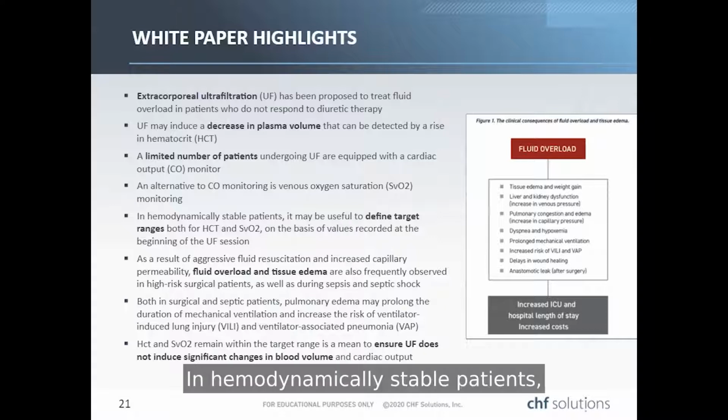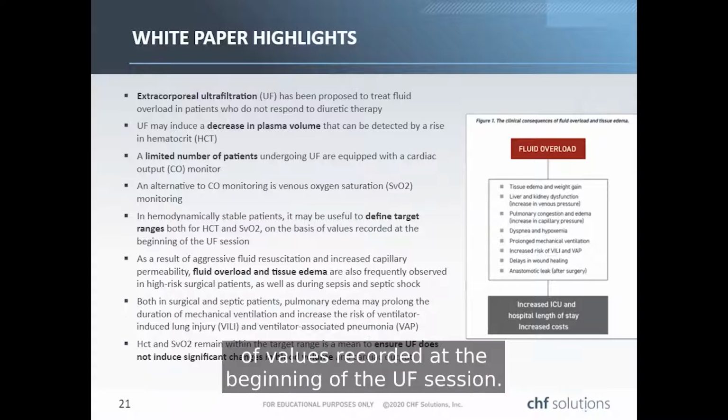In hemodynamically stable patients, it may be useful to define target ranges both for hematocrit and SvO2 on the basis of values recorded at the beginning of the UF session.